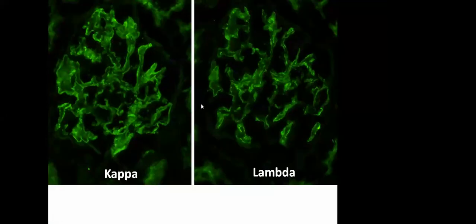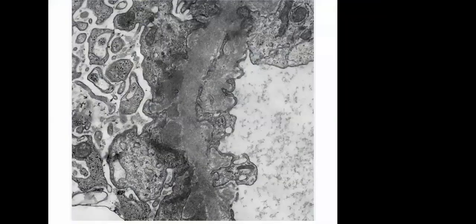So kappa lambda showed equal staining, PLA2R was negative, and there were these kind of electron dense deposits which are there on the subepithelial side. That means we are dealing with membranous. But along with that, towards the subendothelial side also, there was some subendothelial expansion with multilayering. So this suggests that there is a combination of MGN as well as chronic antibody-mediated rejection.